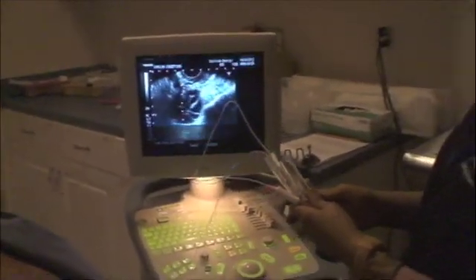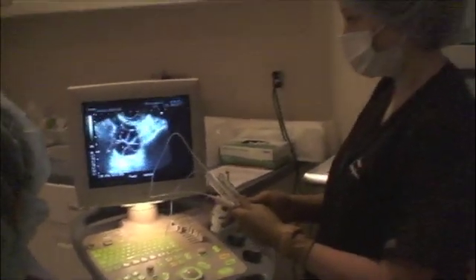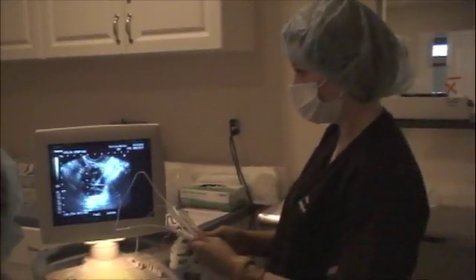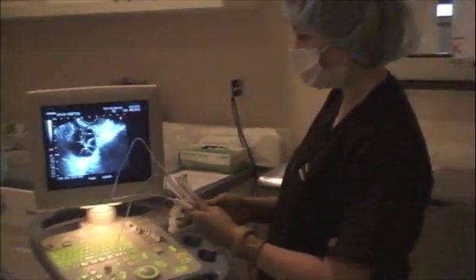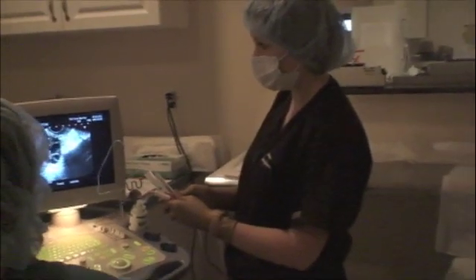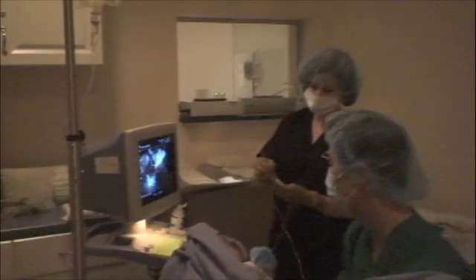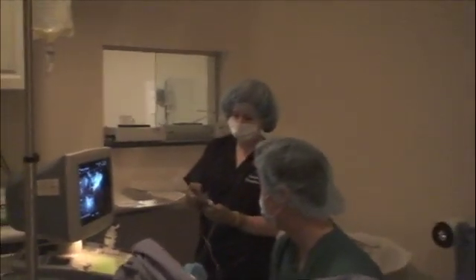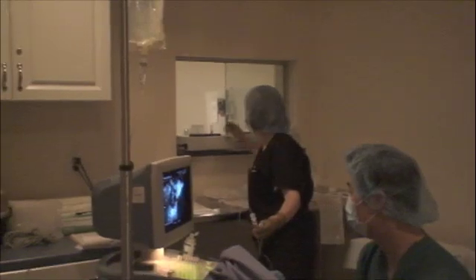The eggs are contained within the follicular fluid, so this fluid will be examined for the presence of the eggs. Once I drain all of the follicles from one ovary, the needle is then passed through the other side of the vagina into the opposite ovary, and all of the follicles from this ovary will be drained as well. The procedure only takes somewhere between 10 and 15 minutes to complete, and by the time the patient is waking up from anesthesia, we usually have a complete count for the total number of eggs that we've retrieved.